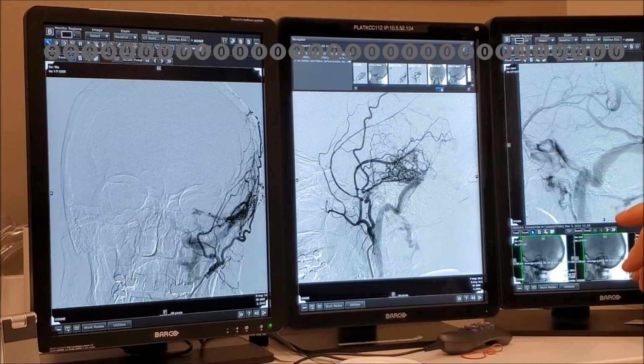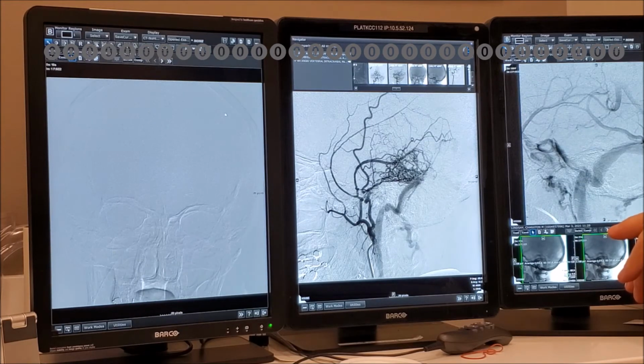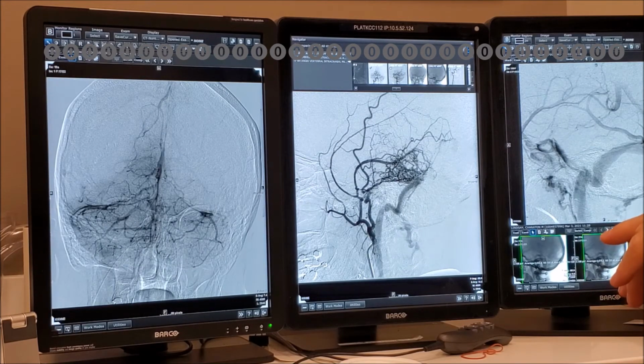When you're going to close the sinus, you should look at the venous drainage of the cerebellum to make sure that you don't block a vein. The biggest danger is to have a hemorrhage from the drain. So you see, this is the dominant vein. So you just have to trap it from here downwards that way.